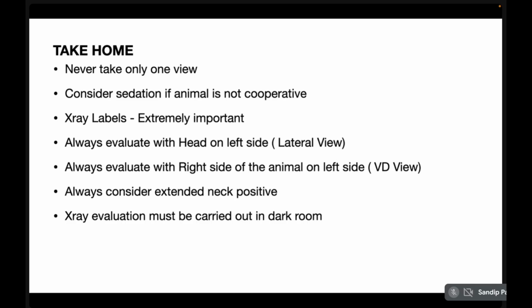At the end, I would like everyone to take some tips at home. Never take only one view. Consider sedation if the animal is not cooperative.